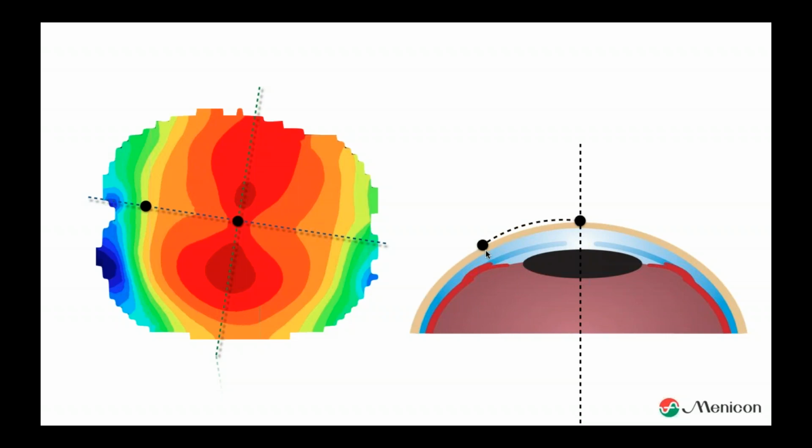So if you say, okay, I have to say something about this point, but I have to relate it to that point, what kind of curvature do I need to connect those two? You can imagine that if you want a part more in the periphery of the eye, it's still the sagittal map, so I have to relate everything to the center part. What kind of curvature do I need now? You understand that this should be a flatter curvature than from this point to this point.